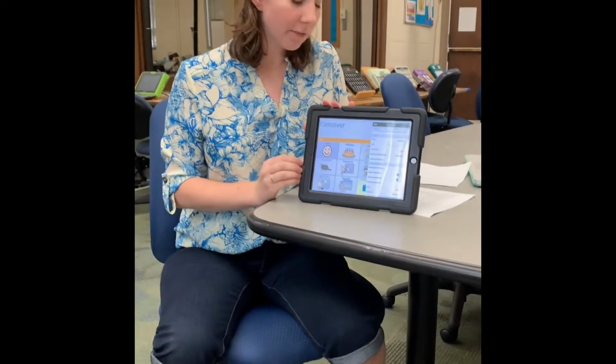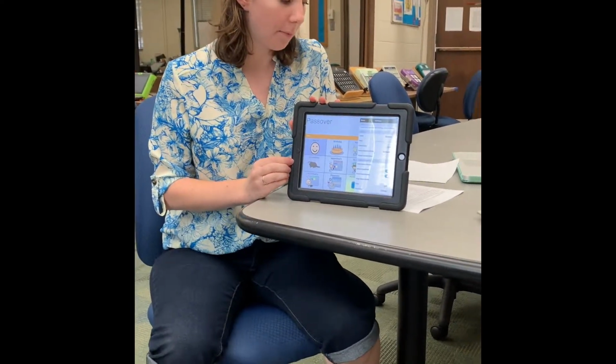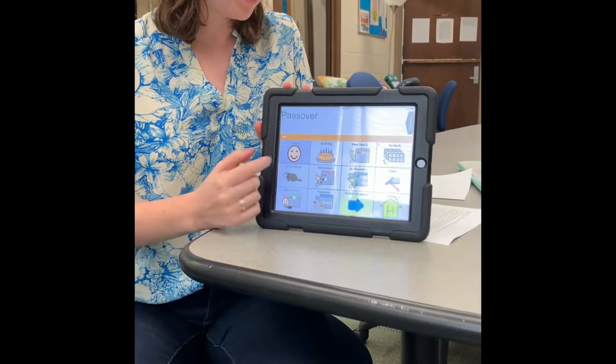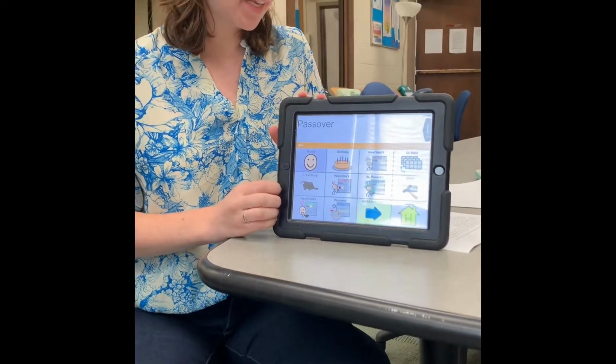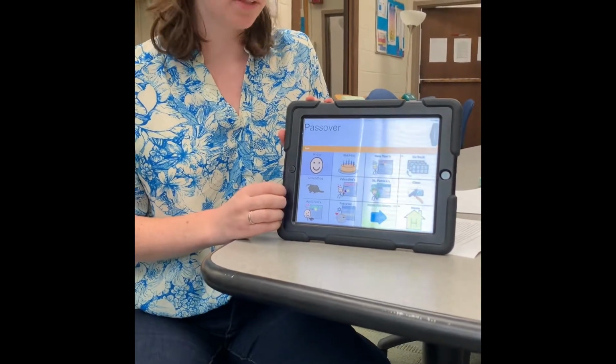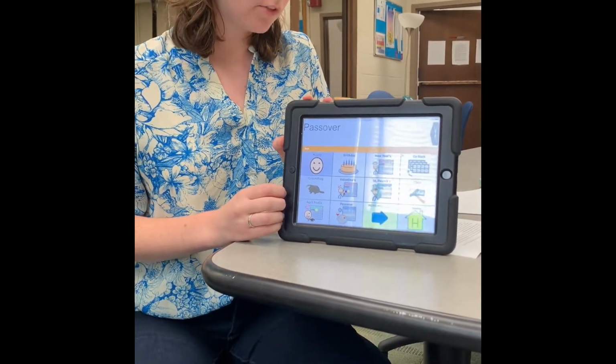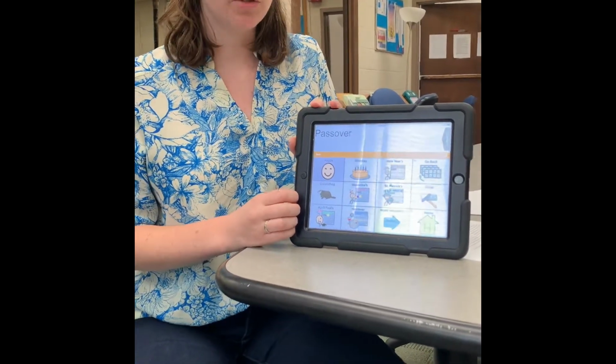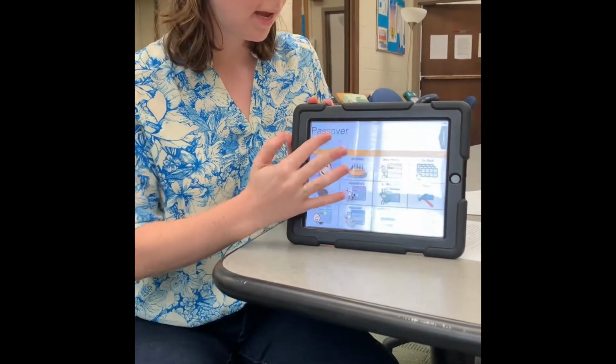Users also have extensive control over the text size and font and the number of lines on the device. The speech display bar at the top of the screen automatically adjusts any text that is entered to a size that only fills 60% of the screen. For example, if a user selected 12 lines of 48-point font, the font would be reduced to a smaller size so you could read all of it at the same time.